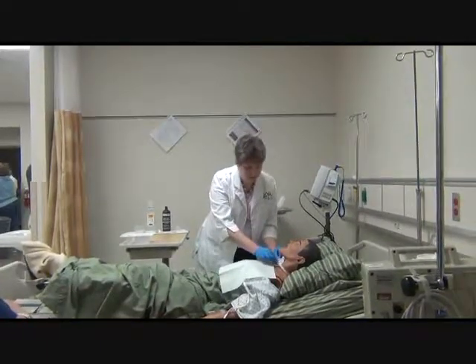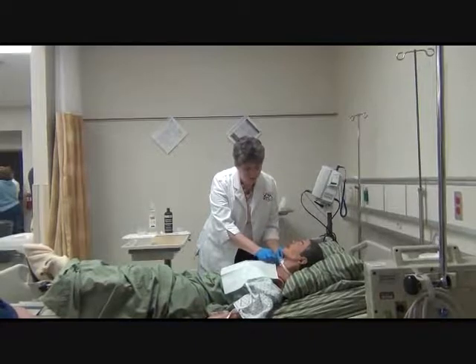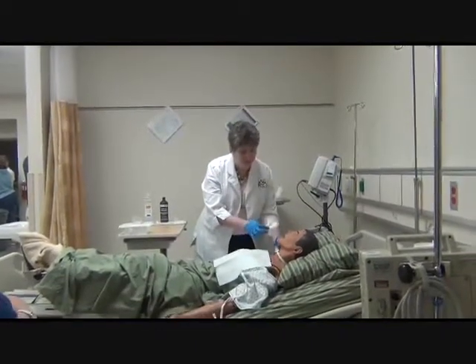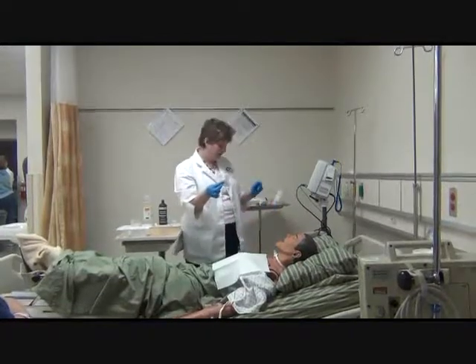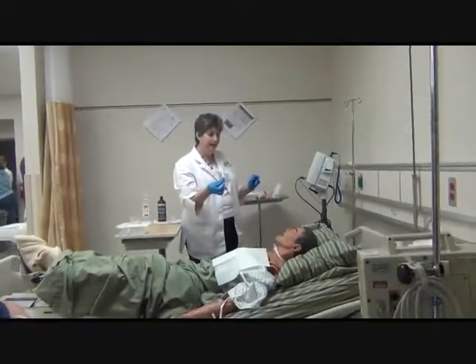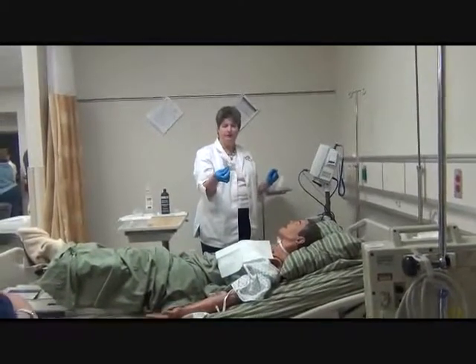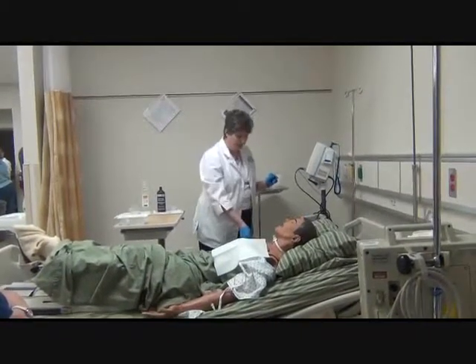Okay, so at this point, what I want to do is get rid of the drainage dressing that is around that. These are usually pretty messy with blood and bacterial discharge, serosanguinous discharge. If this is a new trach, we're going to throw that away.